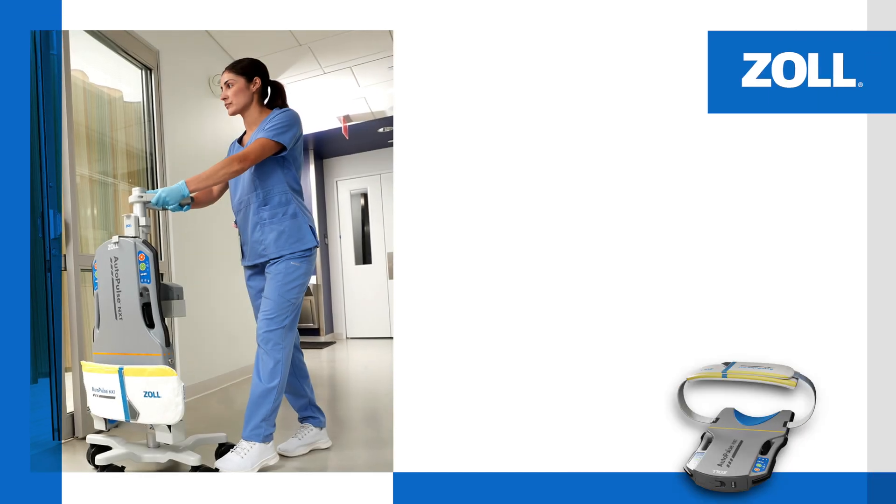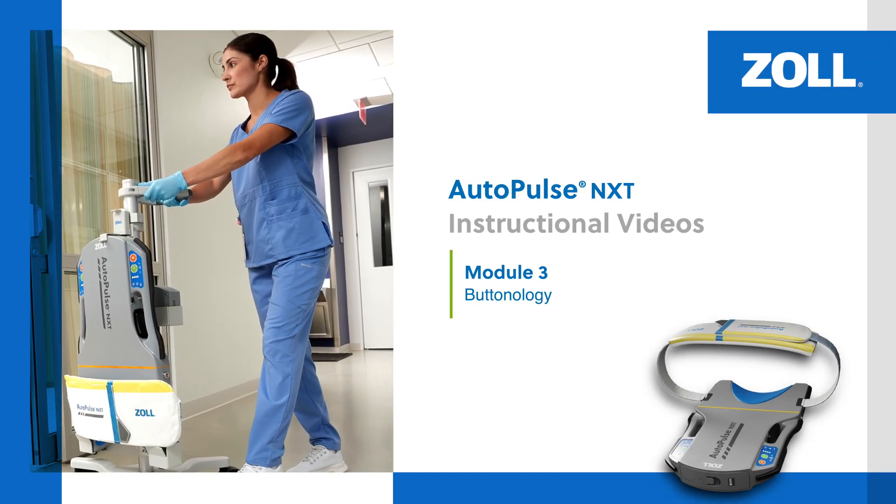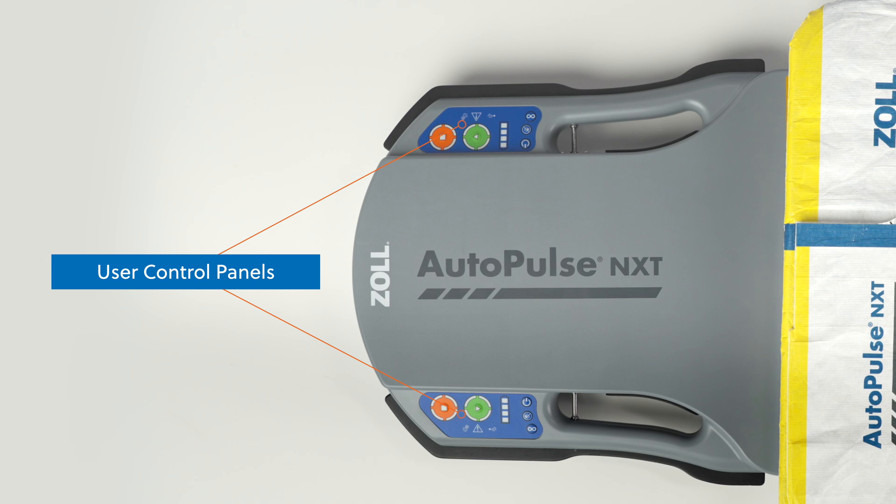In this module, we review the buttonology of the AutoPulse NXT Resuscitation System. User control panels located on each side of the AutoPulse NXT platform enable the system's operation.